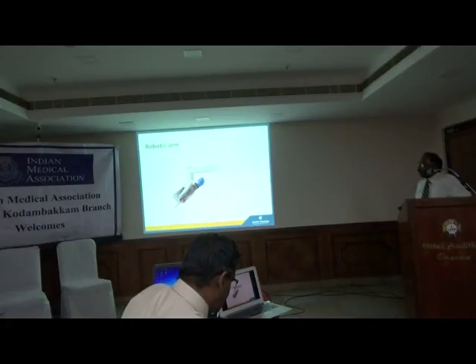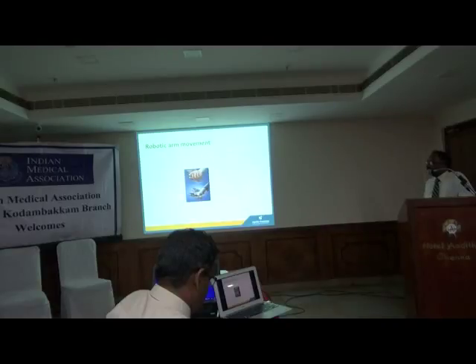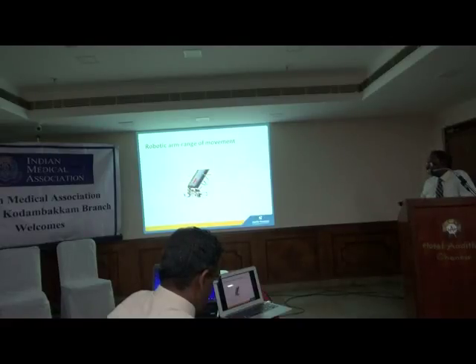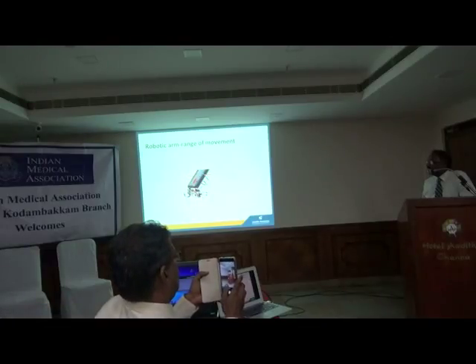So what happens is, instead of the lab, this is a port that is going to the patient. Basically, this is an instrument, and this is a port. The instrument goes through this. We have similar instruments like scissors, holder, graspers, Maryland, all the laparoscopic instruments are more or less the same. The biggest difference in the robot is that in the hand we have a limitation of movement, whereas in the robot it's 360 degrees. So that is where we can hold the needle holder at any angle, forehand, backhand, whatever you want. This is the range of movement: front and back, up and down, sideways, and it's basically 6 to 7 degrees of movement.